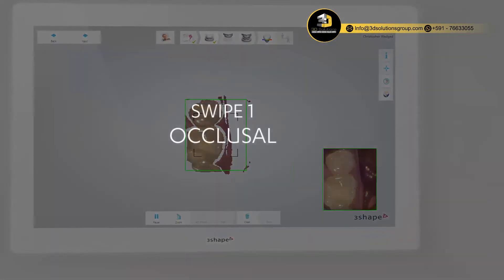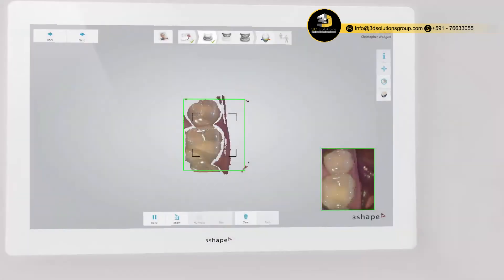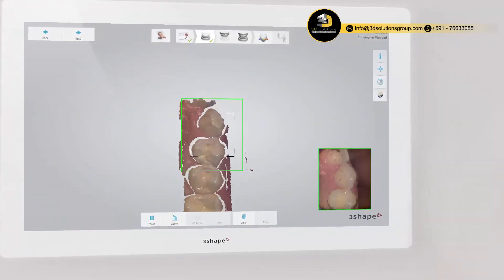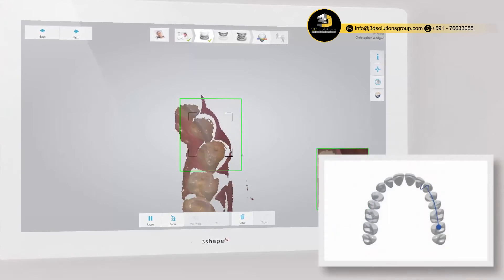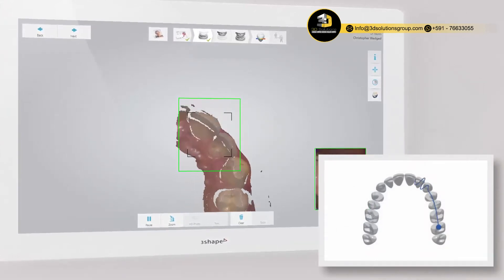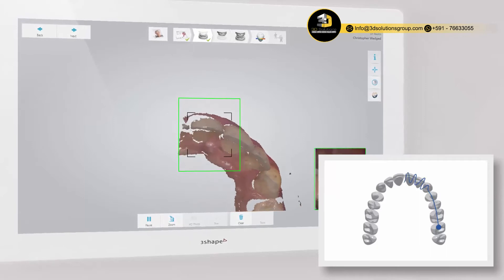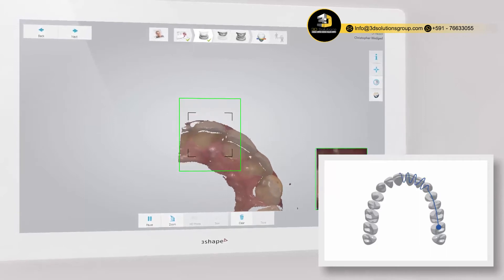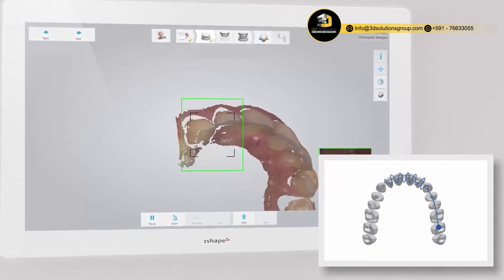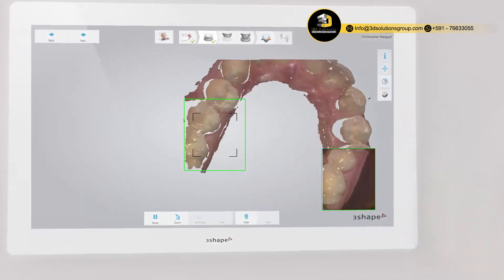Start the scanner while it rests occlusal on the molar. Wait three to five clicks, then move towards the centrals, capturing the occlusal surface. Slowly wiggle the scanner when passing the centrals, and again continue along the occlusal surface until you reach the last molar.